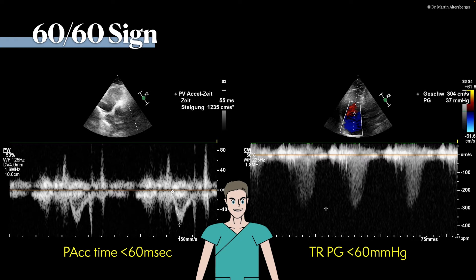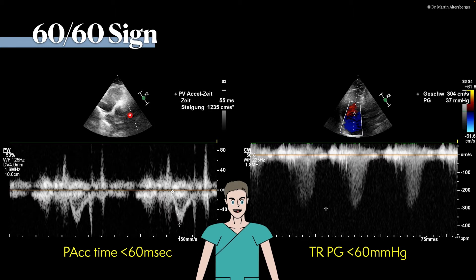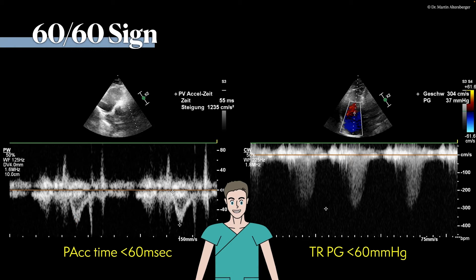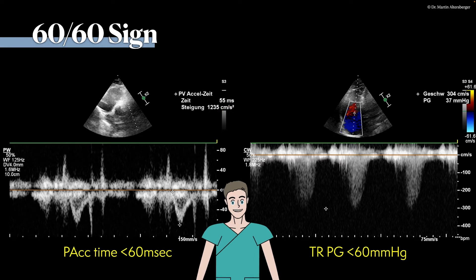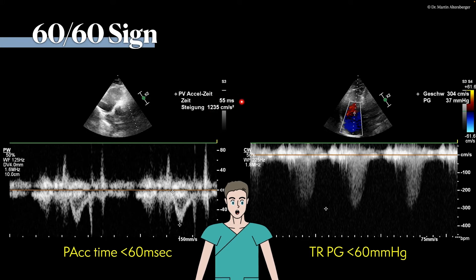Another sign we may utilize in case of a central or hemodynamically relevant pulmonary embolism is the so-called 60-60 sign. We place the pulse wave Doppler below the pulmonic valve and measure the pulmonic acceleration time — the time where blood is pushed out of the right ventricle. In a central or hemodynamically relevant pulmonary embolism, this interval will be very short due to high pulmonary artery pressure. In this case it is 55 milliseconds, so the pulmonary acceleration time is below 60 milliseconds.